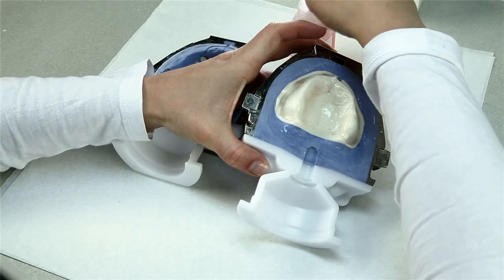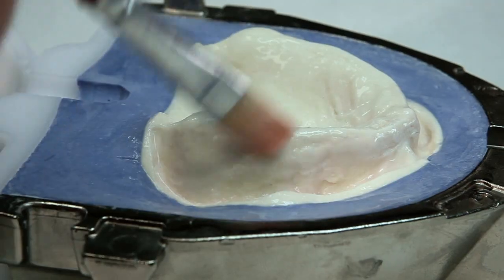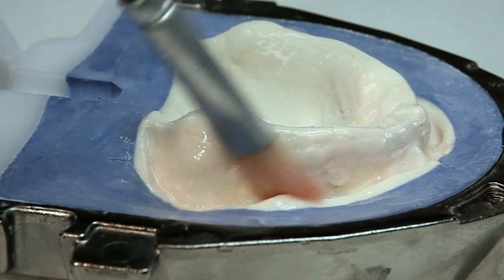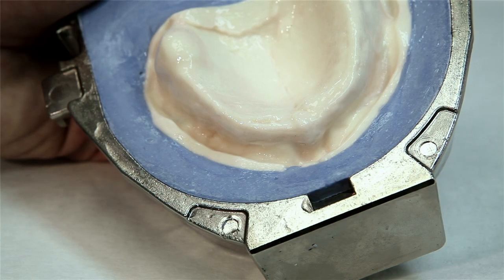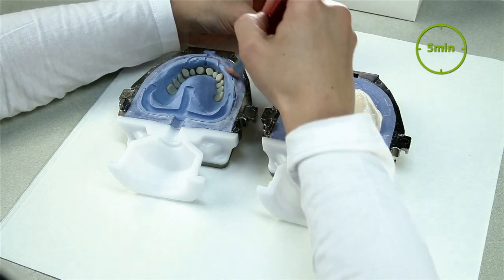Isolate the clean surfaces of the stone model using separating fluid. Prevent the material from pooling, for example in the gingivo-buccal fold. Apply a second isolation layer after 5 minutes.